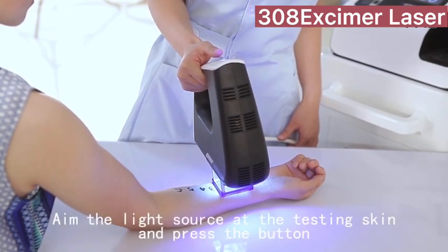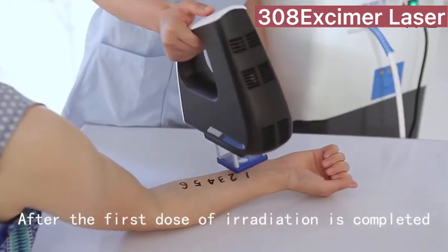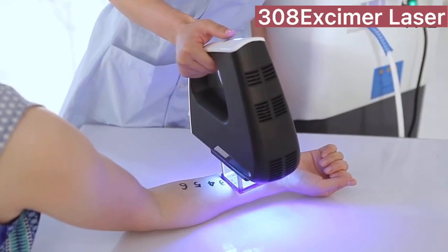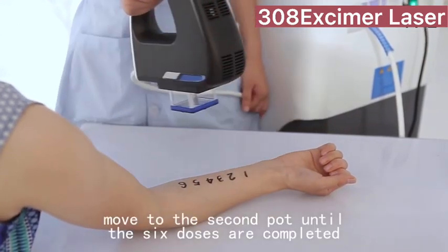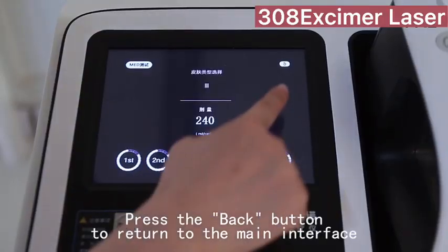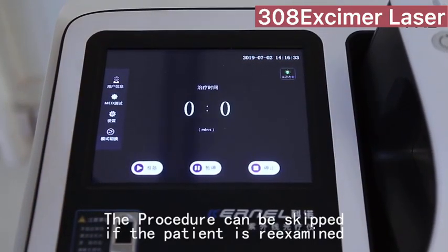Aim the light source at the testing skin and press the button. After the first dose of irradiation is completed, move to the second spot until all six doses are completed. Press the button to return to the main interface. This procedure can be skipped if the patient is being reexamined.